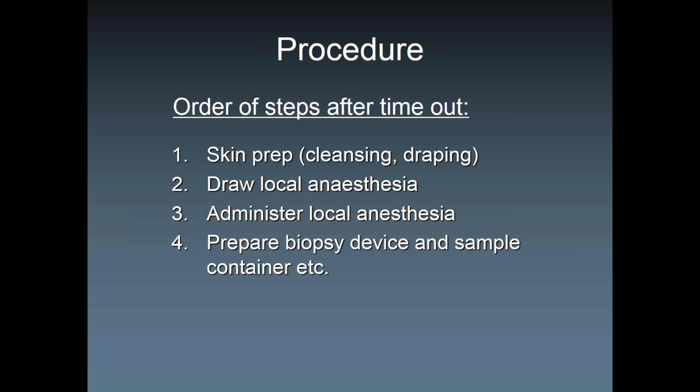So then you inject the local slowly, and while you do that, you let it sit there and act. You don't wait. That's the time where you're going to start to open your biopsy device. The sample containers get ready and all that kind of stuff. So these are our precious seconds and maybe a minute or two to get it all ready. Test the device if it's working, if it's the right size, if the introducer fits nicely around the biopsy device and vice versa, and then you're ready to go.